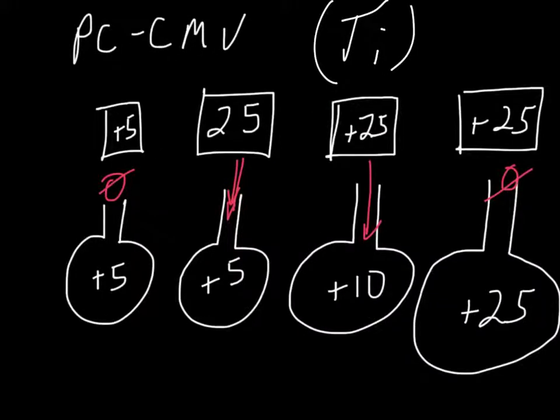So here now we're going to establish what happens during inspiratory time. All right. So here we have exhalation still occurring. There's no flow between the ventilator or mouth pressures and the lungs because they're in equilibrium. But now, right at the beginning, once the ventilator is triggered into inspiration, we have this large pressure gradient between the ventilator, or the mouth pressures, and the lungs themselves. All right? So it's this large pressure gradient across the resistance, which is usually the endotracheal tube, that creates that flow. All right? Now, once the lungs start inflating, the pressure inside the lungs is going to start to increase. That's going to decrease our pressure gradient.